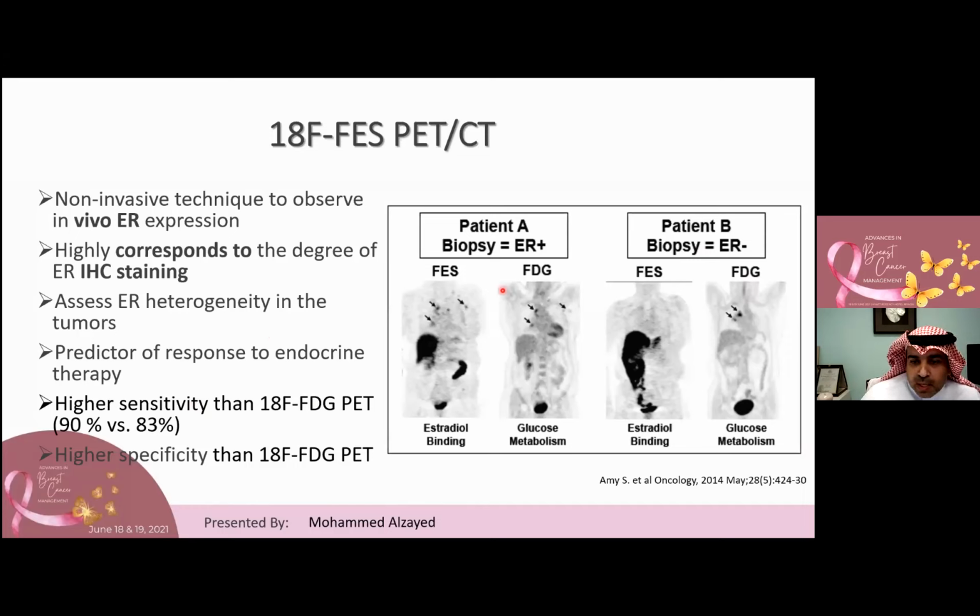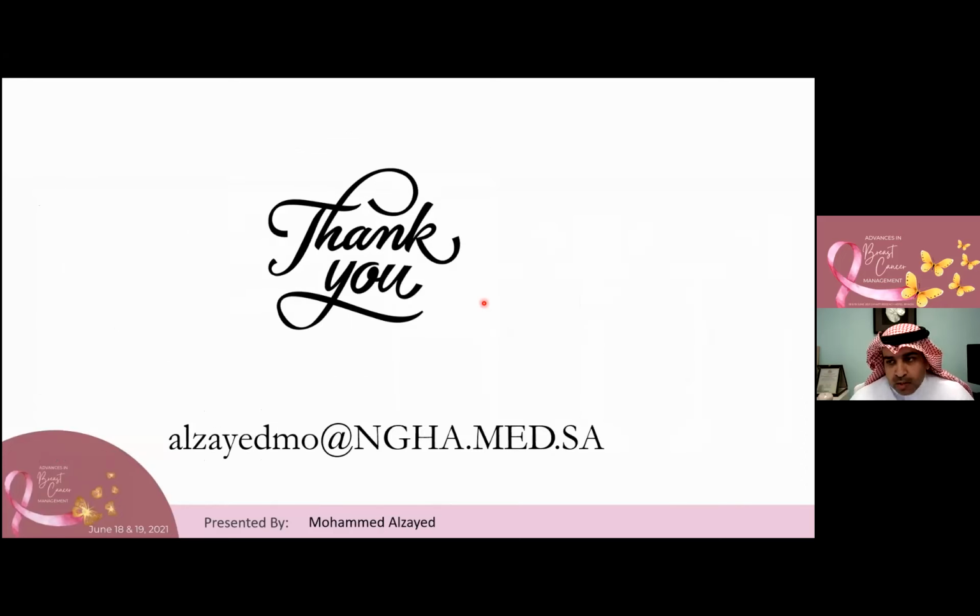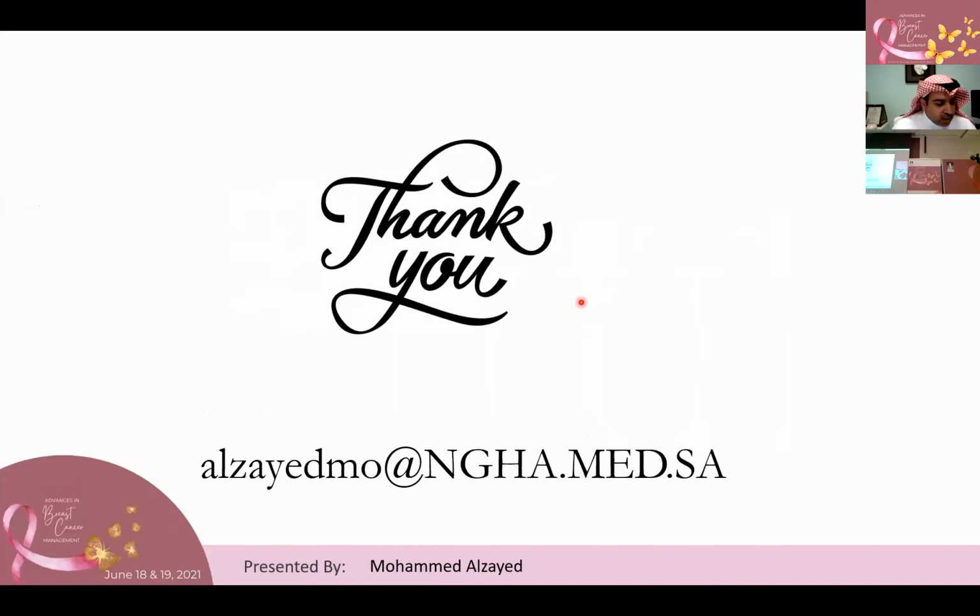This is a patient with ER positive disease, where there is detectability of the metastatic lesions in both FDG and FES PET scan. However, in the patient with negative ER, you see that the FDG shows the disease in hilar lymph nodes. However, they appear negative in FES PET scan. This was my last slide, and thank you for your kind attention.